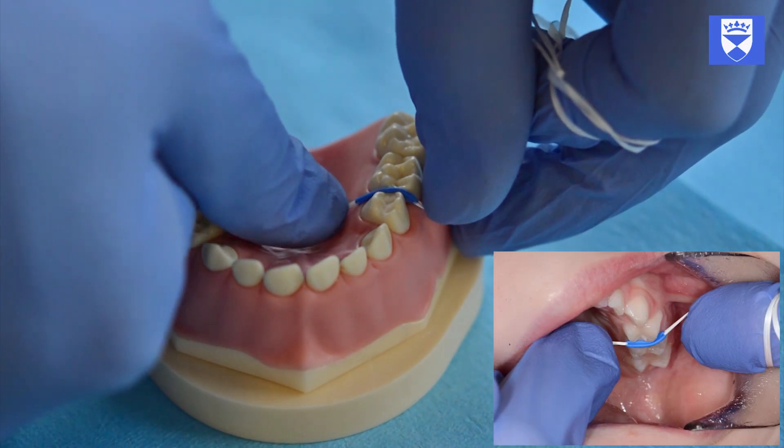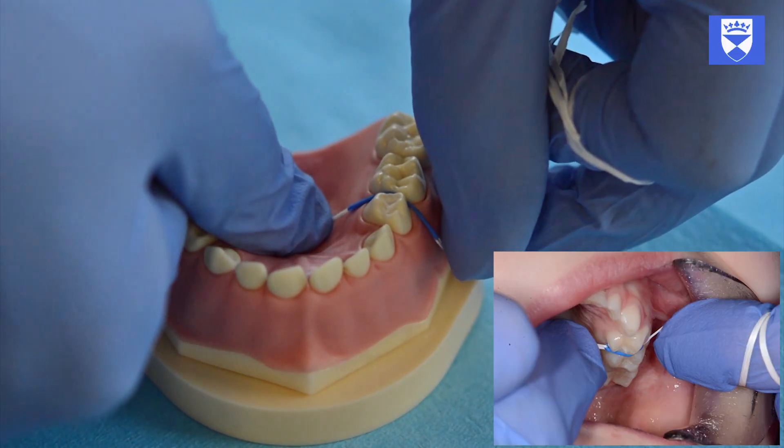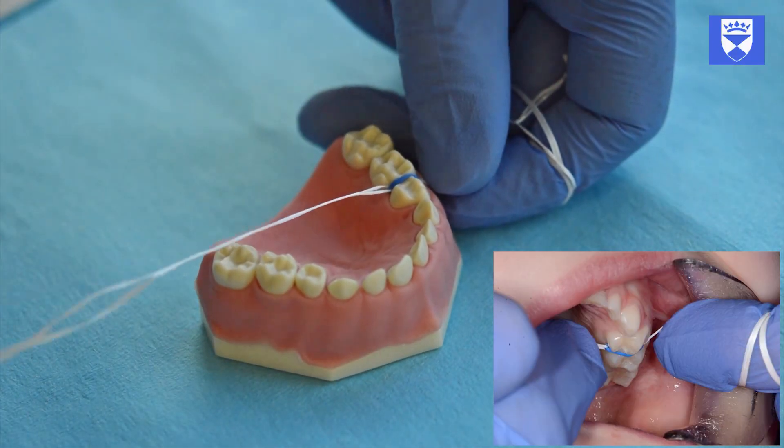The separator must be circumscribing the contact area. If too much pressure is applied, the separator may be pushed apical to the contact point and become submerged into the gingival sulcus.